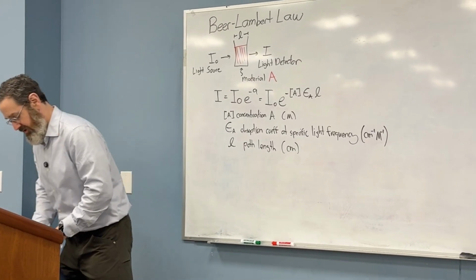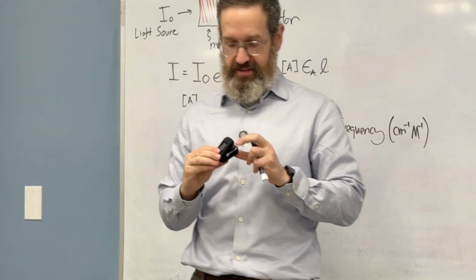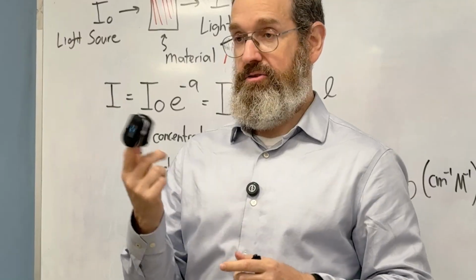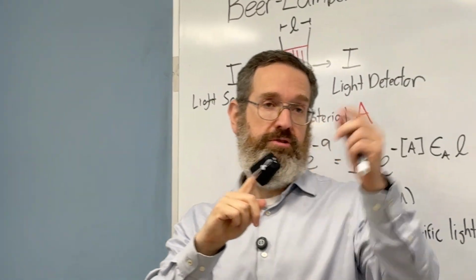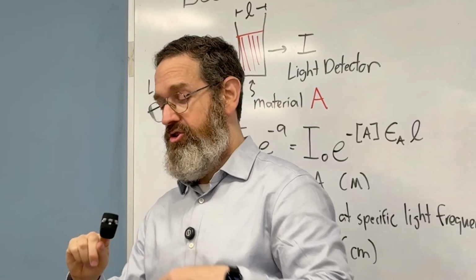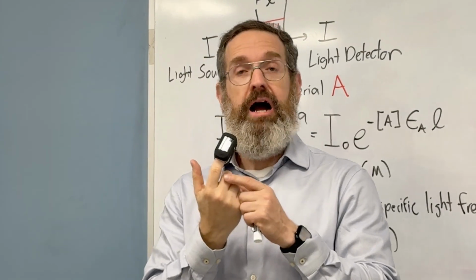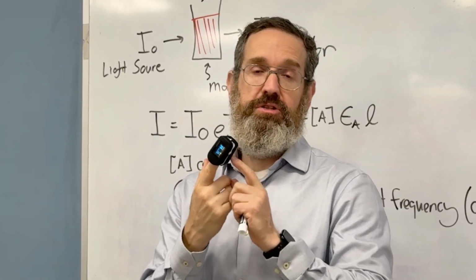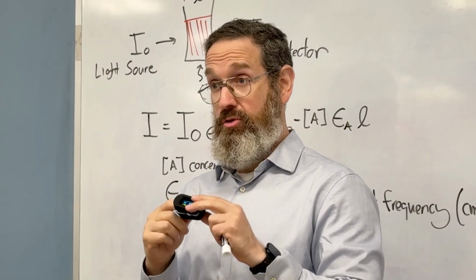Yeah. So the pulse oximeter is this amazing device that is non-invasive, right? You can put it on your finger, sometimes there's a cable on it. My watch has one as well. And it tells you how much oxygen is in your blood. So we're going to explain how that works. And it reports it as something called SpO2. So by the end of today, I'm hoping it'll be intuitive.